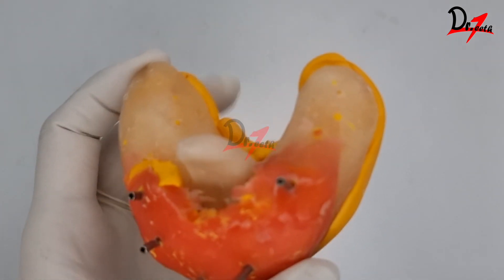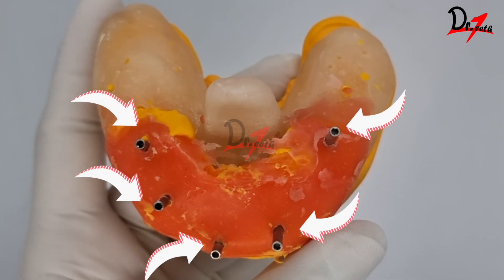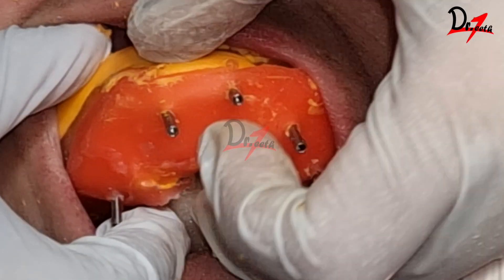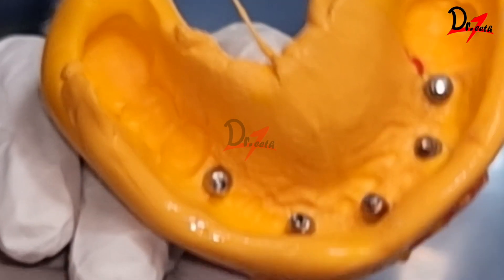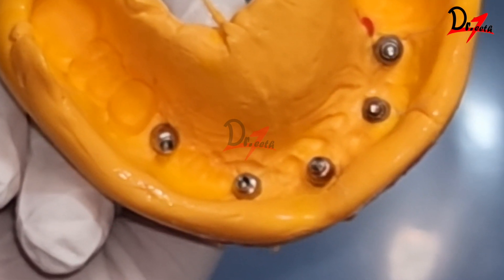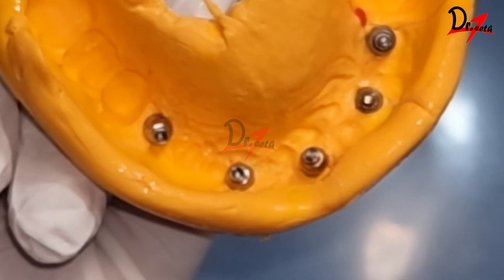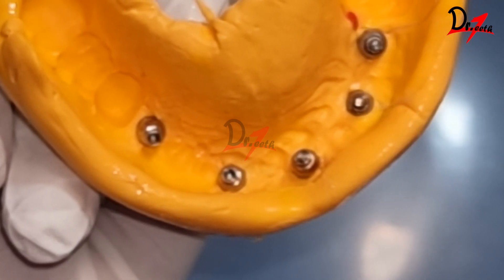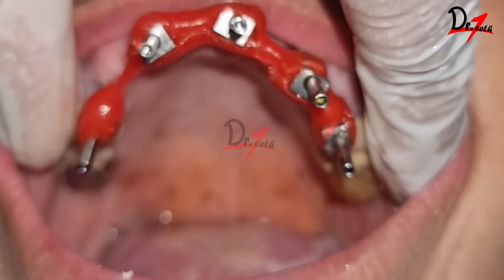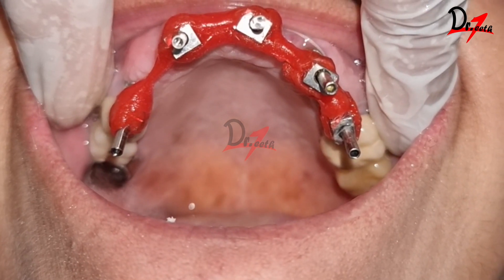As you can see, this is done with the use of an open tray impression coping. This open tray impression coping has a guide pin which can be unscrewed, and the impression can be removed along with the coping, so we don't have to manually place the copings after removing the impression. That is why it is very accurate. The advantages of this technique are that it is one of the most accurate methods of making an implant impression, and we can also splint multiple open tray impression copings using pattern resin, which will further improve accuracy.